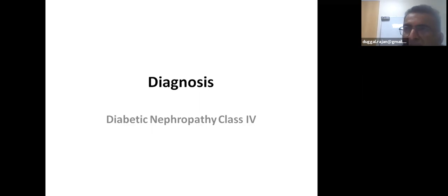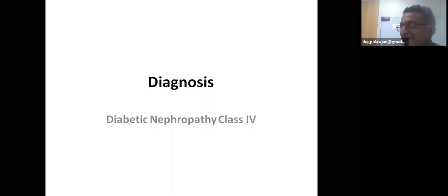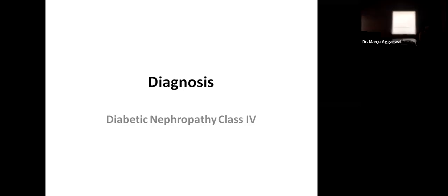So these patients, man, once it is class 4 diabetes, and clinically also you feel like that, you plan for transplant and all that stuff. We tell them nothing can be done. Okay. We call it a fried kidney. At least I call it a fried kidney. Yes, ma'am. I have heard that word from you when you look at these transplant biopsies also, which are like gone. It used to be American terminology. Fried kidney means no kidney.